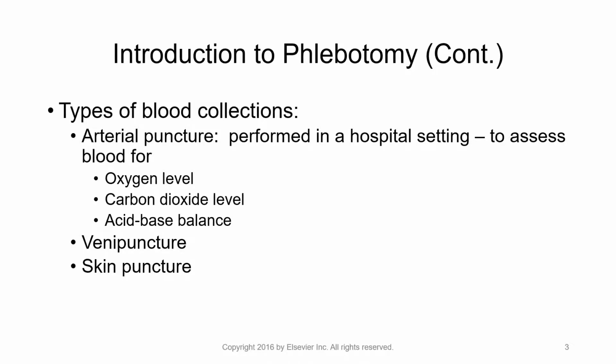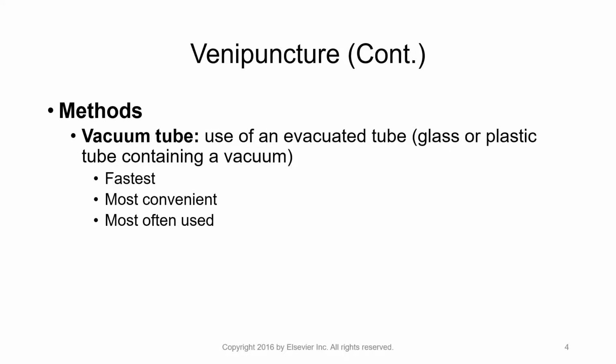Capillary blood is sort of special. It's that in between where blood goes out to the cells through our arteries, and then before it comes back to the heart, blood's going to move through capillary vessels. They're extremely tiny vessels, finer than a human hair, and they don't necessarily carry oxygenated blood. They don't necessarily carry deoxygenated blood. It's sort of a mixture, and that's what we call our capillaries, or in this case, skin puncture. So the biggest category here is venipuncture.